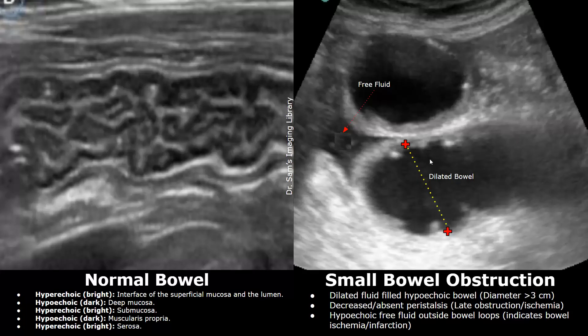There is also hypoechoic free fluid outside the bowel loops. Fluid seen outside bowel loops usually indicates bowel ischemia or infarction.